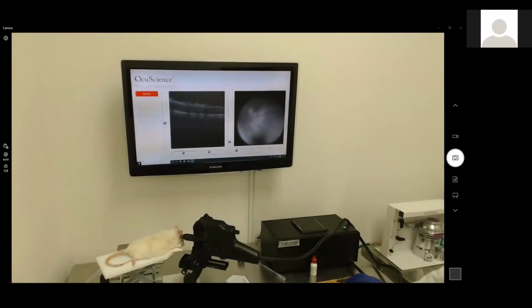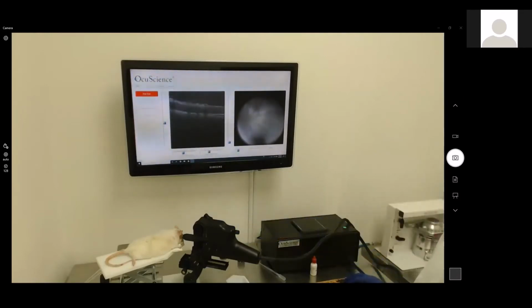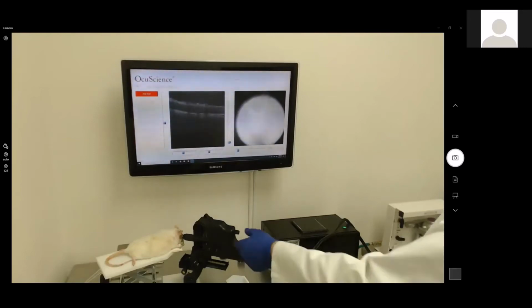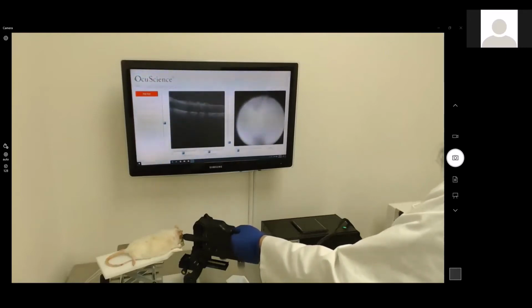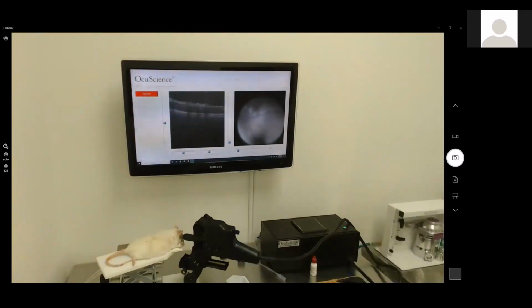And yeah, you can see on the right the correlation of the vessels coming into the optic nerve on the screen. You can see there's kind of a flickering going on in that nice little black circle. That's the lumen of the vessel. What you're seeing flickering through there are the platelets as they're coming through the 2D plane of the OCT. So this is the type of information that we want to capture at the 80 kilohertz range, because once we have that good vessel data and we can see those shear changes, that is the underpinning for doing things like OCT angiography.